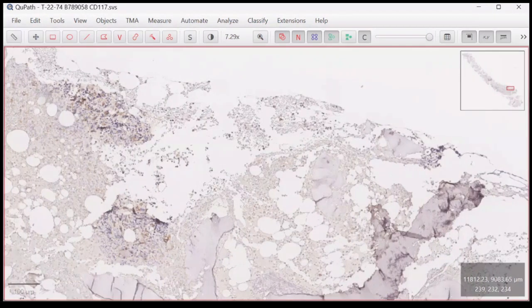You have to say that CD34 and CD117 appear markedly reduced, to more than 75% or 80%, and these cells are distributed individually with very occasional two-cell clusters.